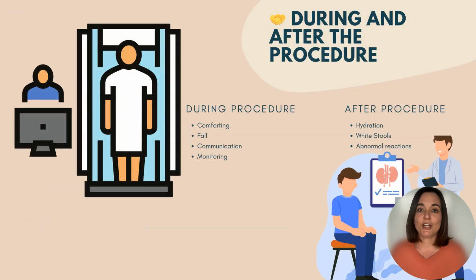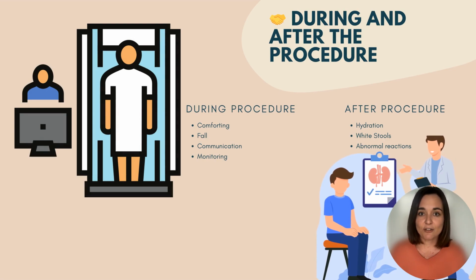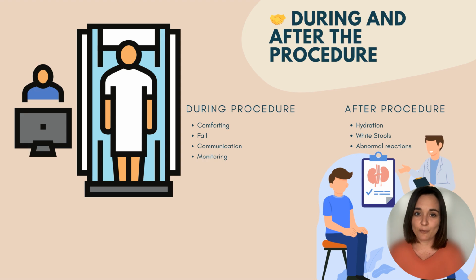During the procedure, ensure modesty and comfort. Make sure the gown's tied correctly and blankets are available. Check for fall risks, especially during upright exams like a swallowing study. Encourage communication. Let them know they can speak up if they're in pain, nauseous, or anxious. Be ready to assist with vomiting, aspiration risk, or emotional distress, especially with pediatric or trauma patients.